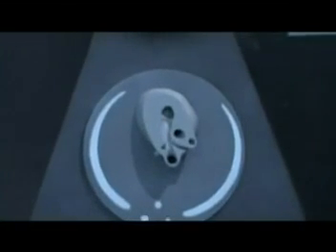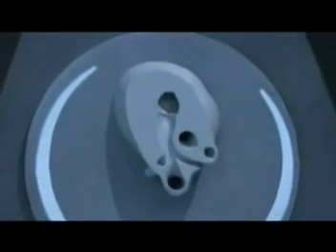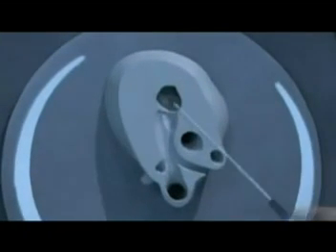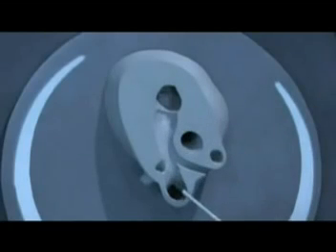When the baby's lying on its back like this, the aortic outflow will be easy to see, but the pulmonary outflow and the duct will be difficult because they're running in the same direction as scan beams. However, this will allow the right branch of the pulmonary to be seen much more clearly, so you need to move your probe around the patient to orientate onto the baby to try and demonstrate the right branch.